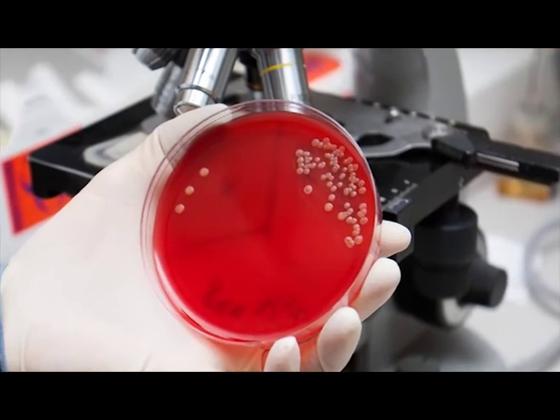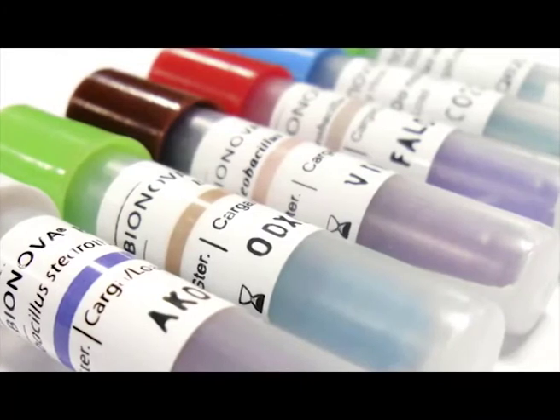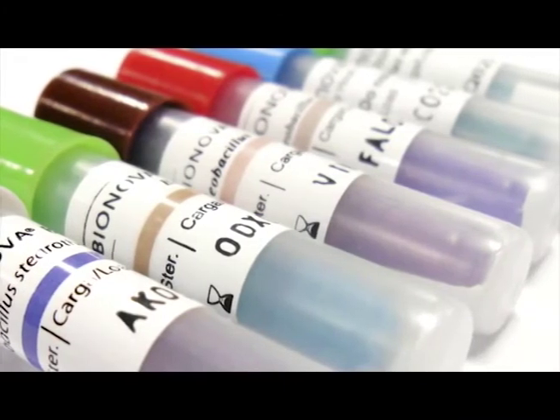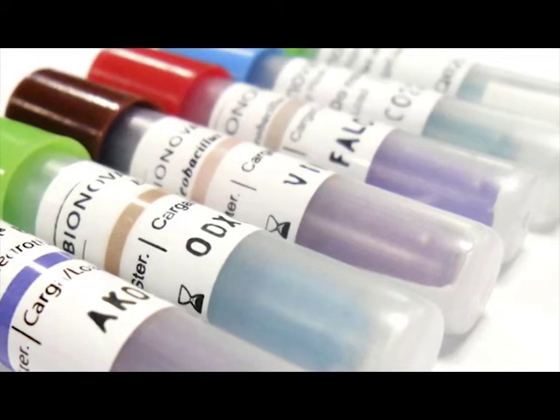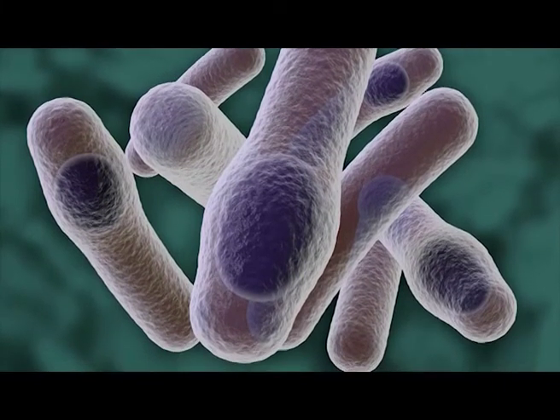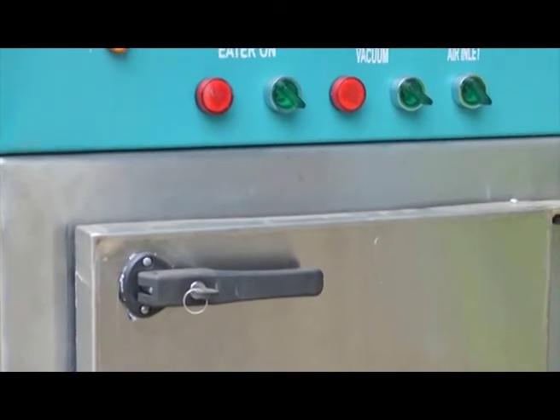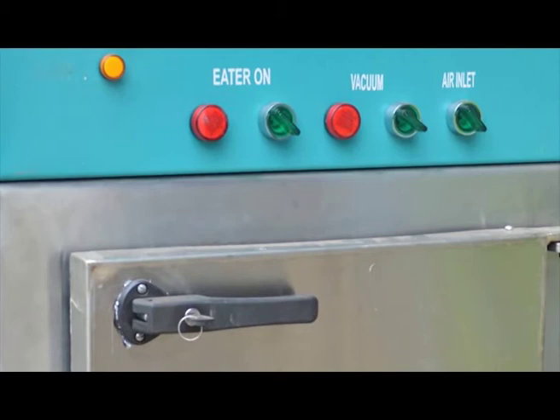Second is the bacteriological indicator, kept in the center of the pack before the process and later subjected to lab testing for colony count and growth. A pack of non-pathogenic bacterial spore, Geobacillus stearothermophilus, is placed in each load to check quality. Clostridium species is generally used as the dry heat sterilization indicator. If the level of sterilization is satisfactory, the green or brown color changes to black.